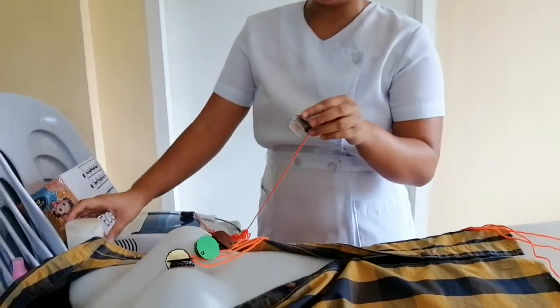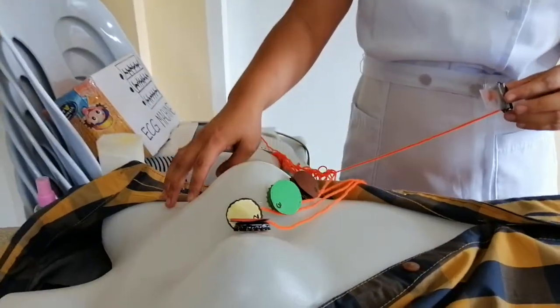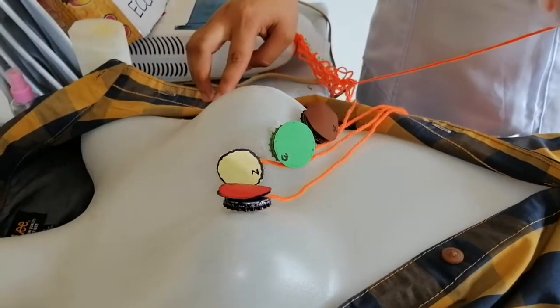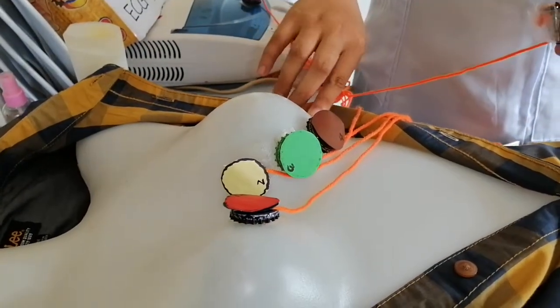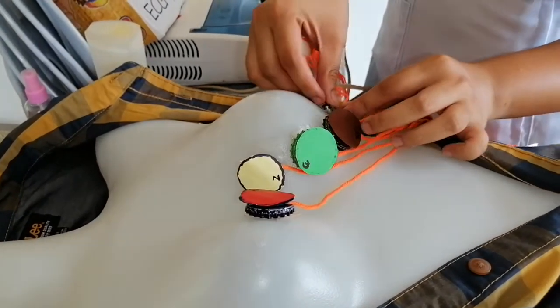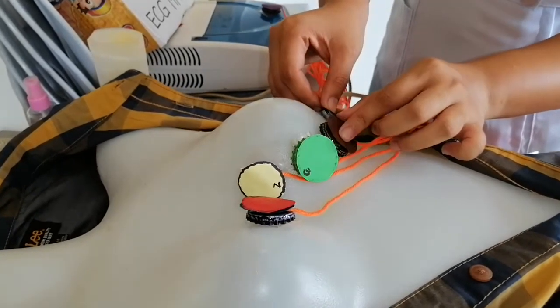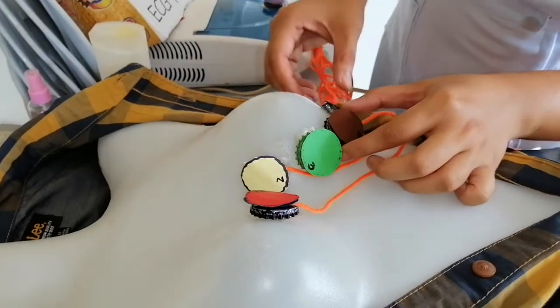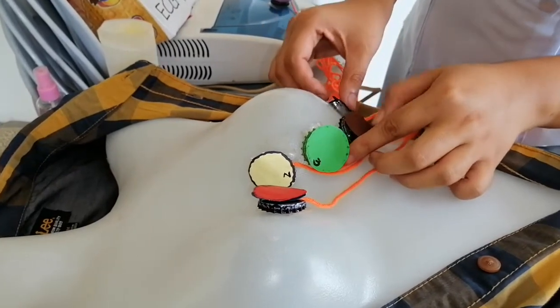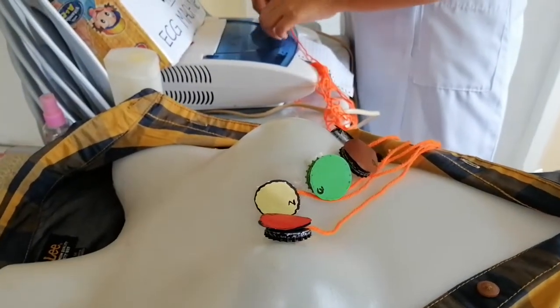The location of this V5 is found at the anterior axillary line going down, or just draw an imaginary line going beside V4. Beside V4.